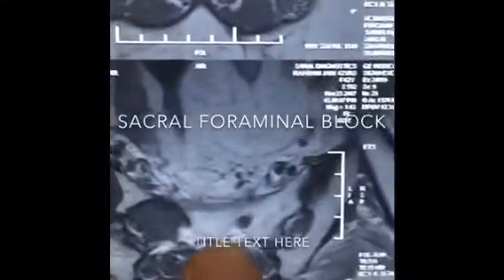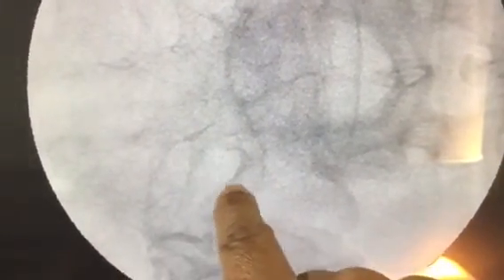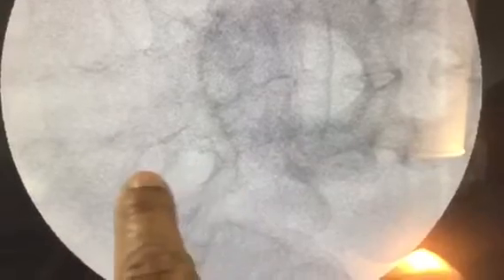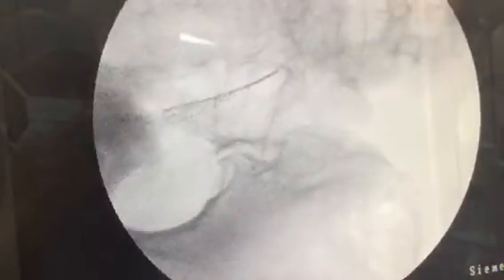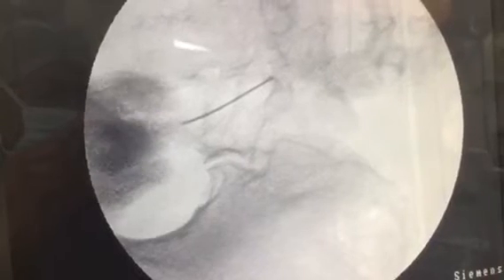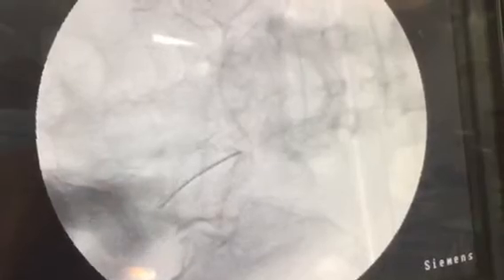This can be given in the sacral first and second foramina. In this case, the patient has a tumor compressing the right-sided sacral nerve. You take the needle up into the foramen and hit its superior or medial wall, then inject the xylocaine and corticosteroid injection. This will relieve the compression of the tumor on the nerve, and the patient's leg pain will improve, as has happened in this case.